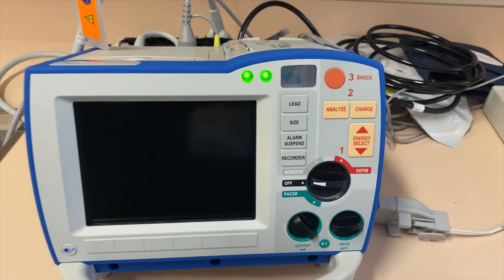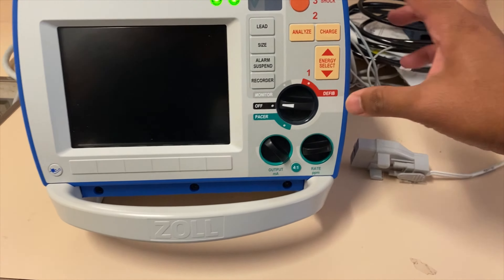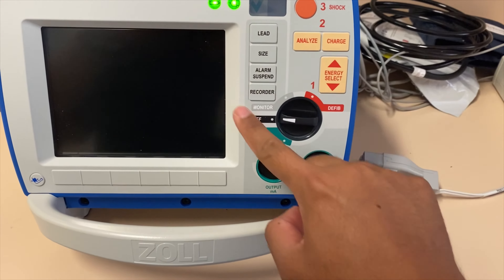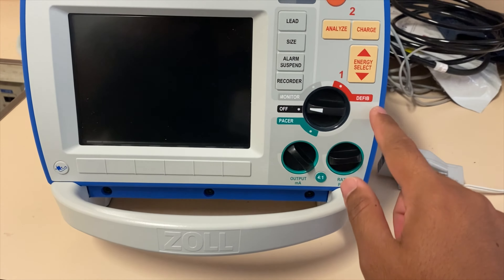So the Zoll defibrillator — if you notice in the front, it has three colors. The red or orange color pertains to your defibrillation. The gray area is for your monitor. And for your pacing, it is the green area.